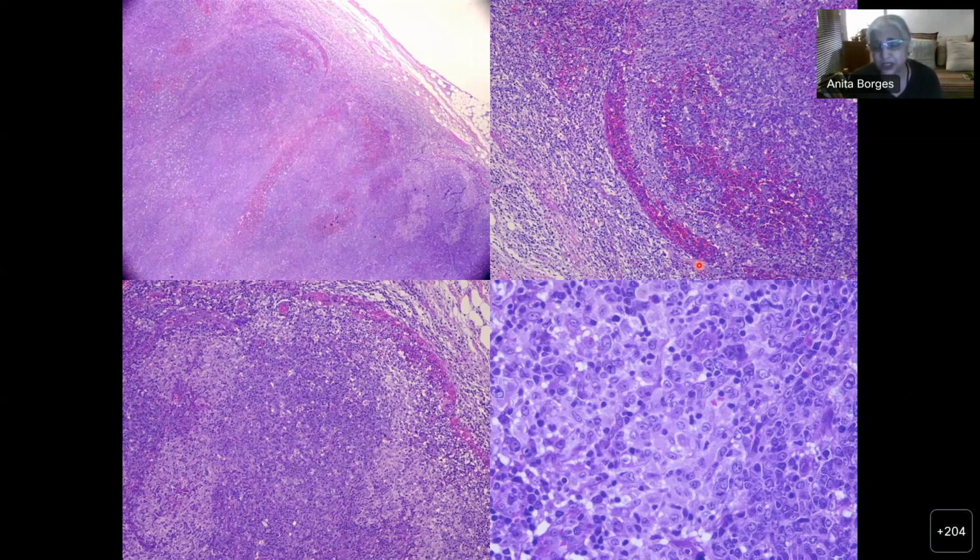They're so congested, and these are not blood vessels. These are lymphoid sinuses. But that's what you notice in many cases of this kind. Okay, they have a lot of blood in these sinuses. You can also see that there is extravasation of RBCs within the lymph node.